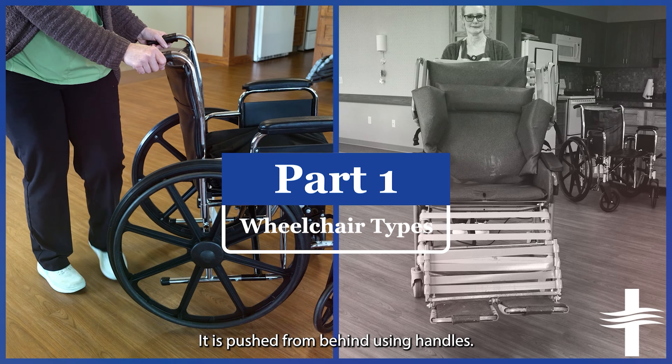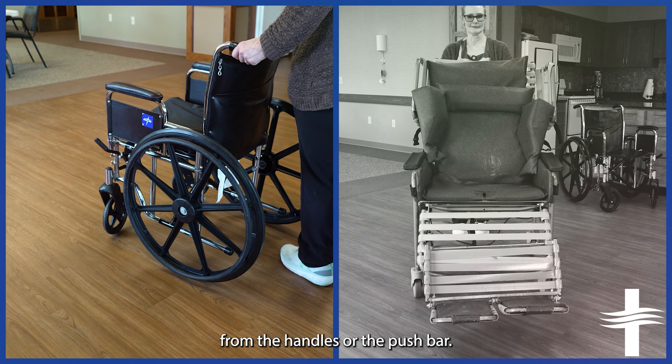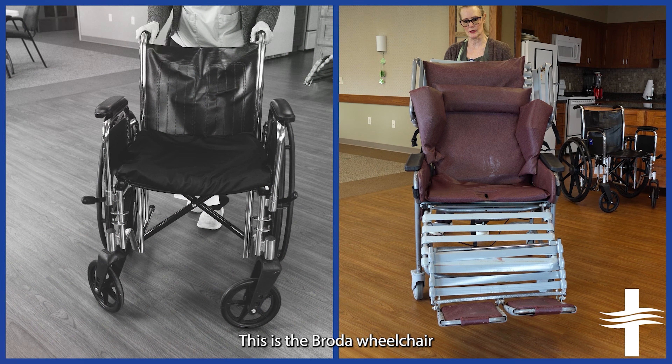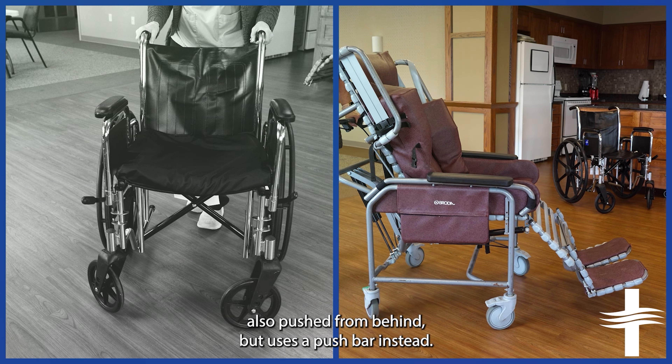Here are the wheelchairs you will encounter while volunteering. This is the manual wheelchair. It is pushed from behind using handles. When assisting a person in a wheelchair, only push the wheelchair from the handles or the push bar. This is the Broda wheelchair, also pushed from behind but uses a push bar instead.